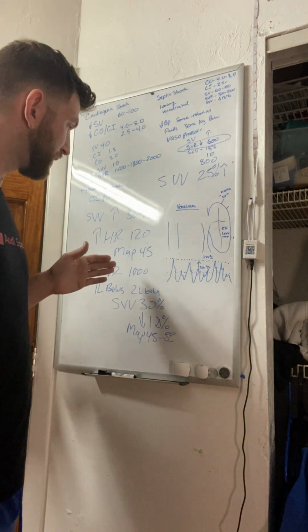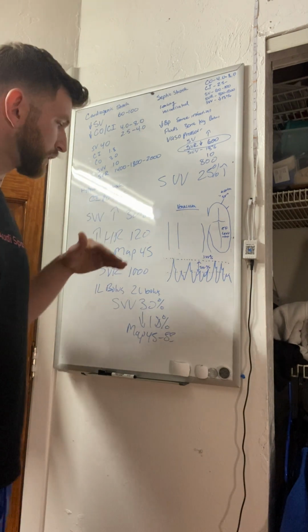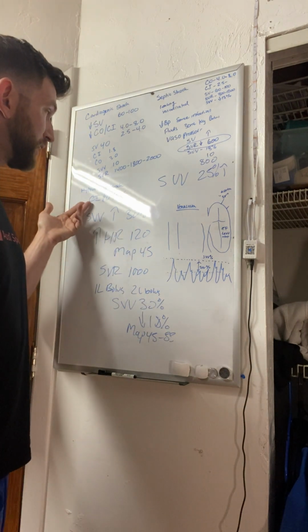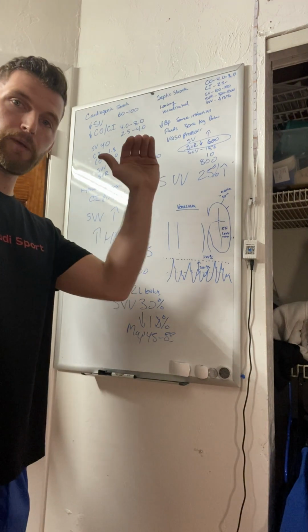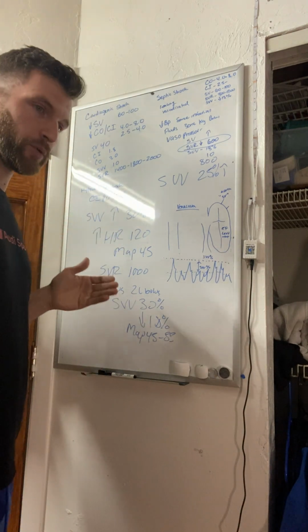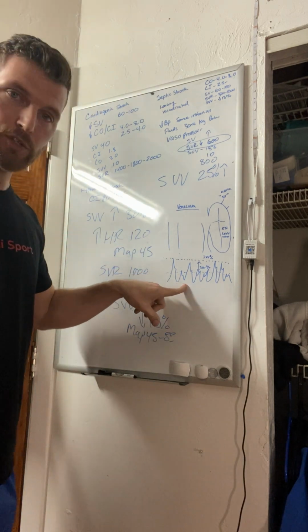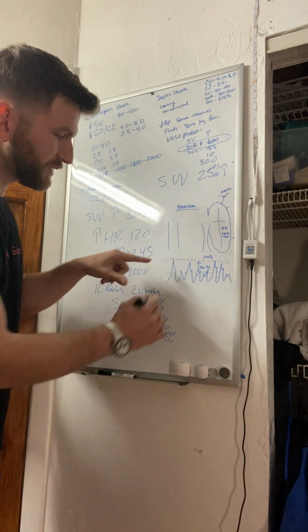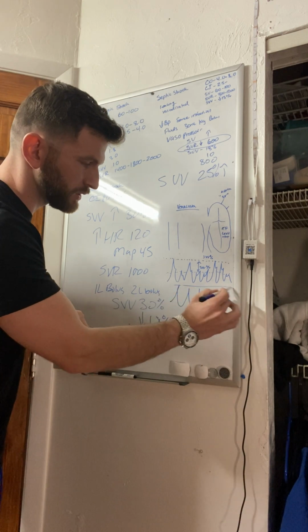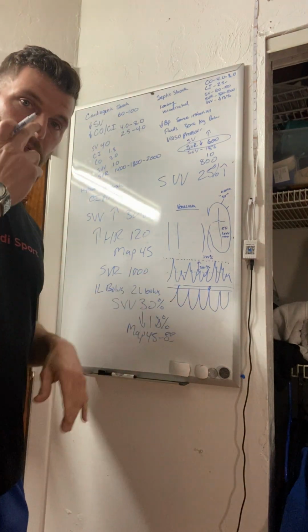Your SVV is super high, everything else looks kind of normal. Maybe the cardiac stuff is a little on the lowish side or even low normal. But as you improve their SVV and as you fill the tank, you may see the cardiac index, output, and stroke volume just go right on up because you're resupplying the right side of the heart, the preload, and because of that, your blood pressure improves. But the sign that you'll see on the monitor is that the SVV starts to go down, and on your arterial line waveform, what you'll actually see is a more normalized peak, where everything is a little more normalized and the variation between the peaks is minimal, and instead of being closer to like 30%, now it's closer to 13%.